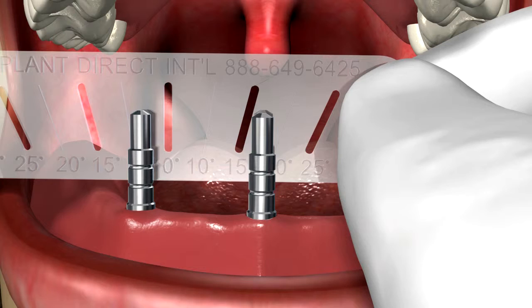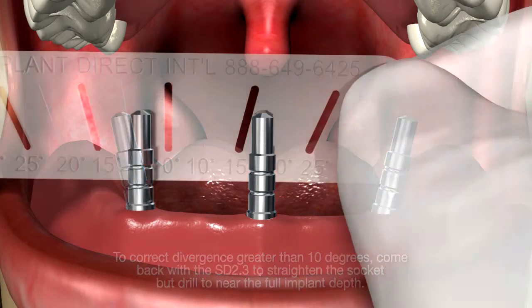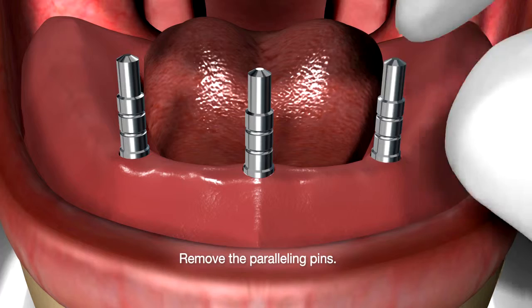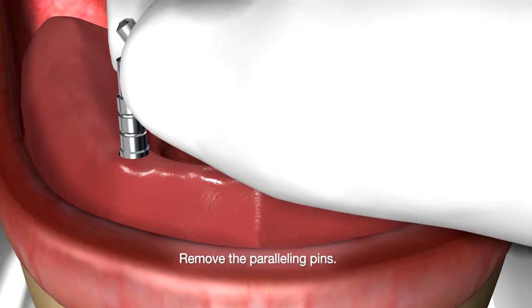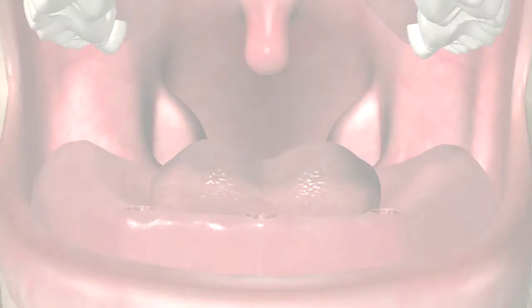If they're off, then it'd be a good idea to straighten them out with your next drill. In the case of the pointed ones, if you've only penetrated halfway, you could use the same 2.3 drill and just finish the depth of the preparation as you realign the implant.